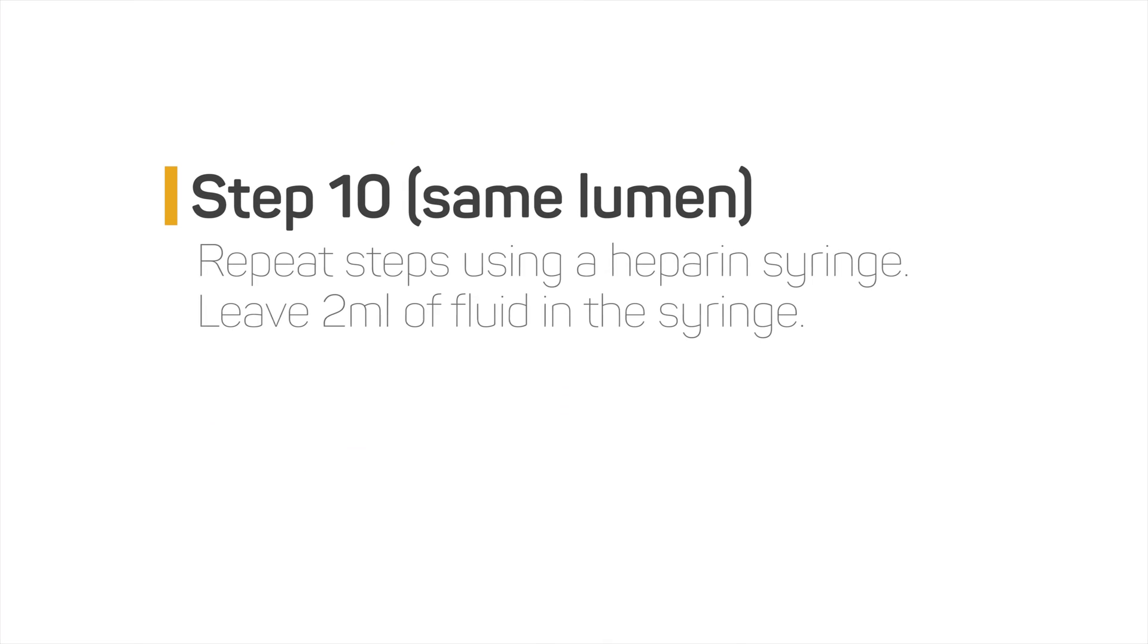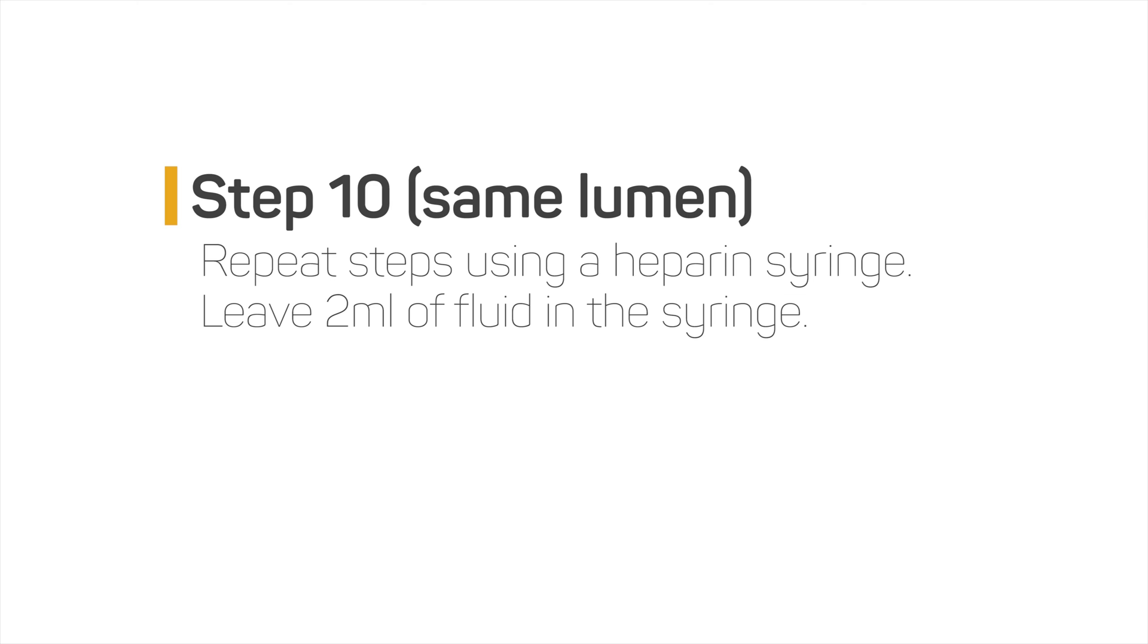Step 10 same lumen: repeat steps using a heparin syringe. Leave two milliliters of fluid in the syringe.